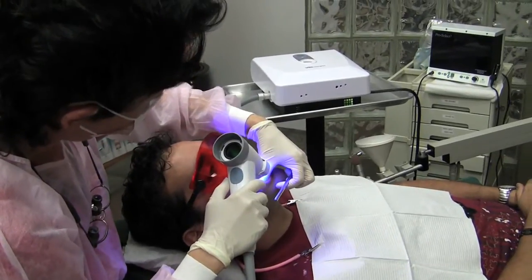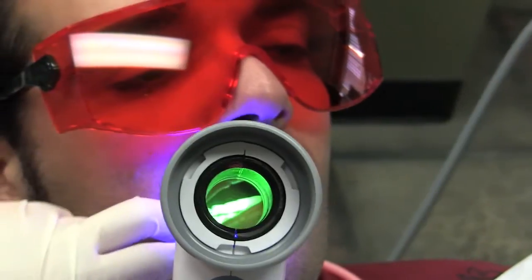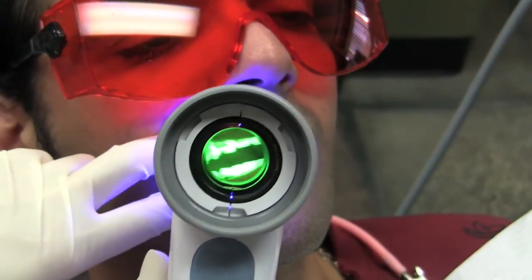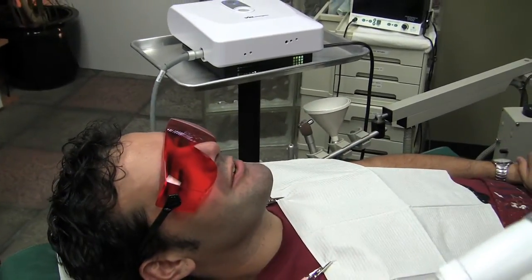Then we can go further to investigate. It's very easy to detect any abnormal tissue just by using this Valscope. Excellent. Thank you.